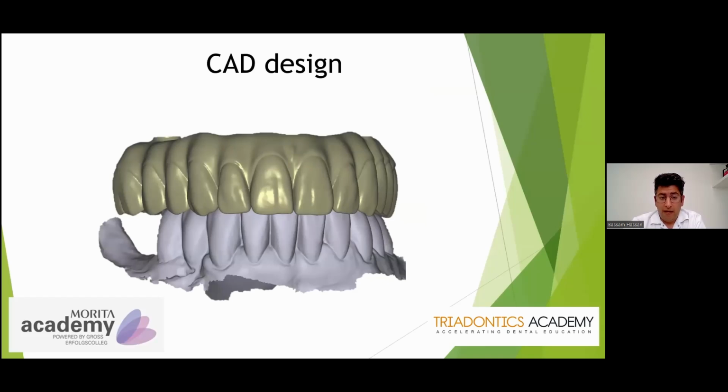And I remember this used to be a quite stressful moment for me. If I have an intraoral scan of a full arch on like 4 to 6 implants, is it going to fit? Now I actually don't really give it a second thought. They always fit.